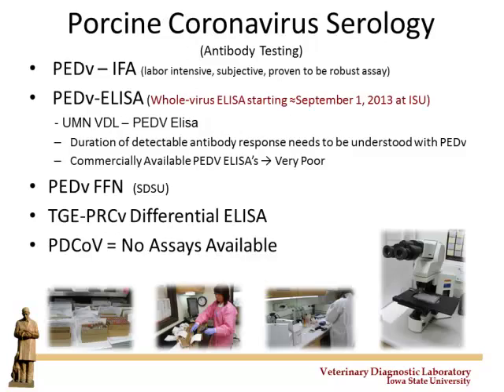Serology. One thing I've learned about this program is that PCR technology and developing PCRs is a much more straightforward plan than getting a good serology tool in place, okay? We've had some luck, not quite as fast, but we've had some luck with the PDV, and really that came about through traditional technology, but the core to be able to do that was you had to grow the virus. Okay, so we had to be able to cultivate and grow the virus to get this IFA assay. And that's really held up, it's robust, it's kind of stood the test of time.